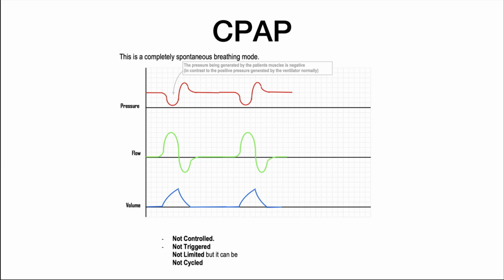When the patient exhales, pressure from the deflating lungs and chest wall pushes air out against the continuous pressure until the two pressures are equal. The air pressure in the airway at the end of exhalation is equal to the external air pressure of the machine, and this helps to splint the airway open, allowing better oxygenation and airway recruitment. If the CPAP is set too high for the patient, exhalation becomes very uncomfortable, since the patient has to push against the pressure to exhale. This can increase the work of breathing for fragile COPD patients or weak critically ill patients.